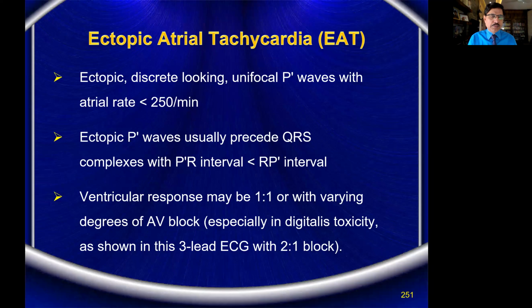And we also knew that if the rate is decreased, A will not be conducted, B becomes A, and C becomes B, and D will be the one which is conducted. And if the heart rate is faster, the reverse happens. So this also we understood.